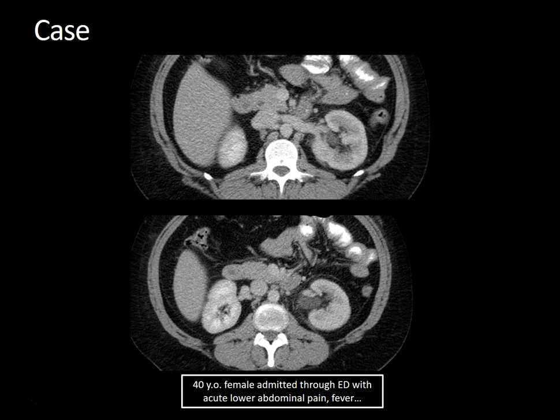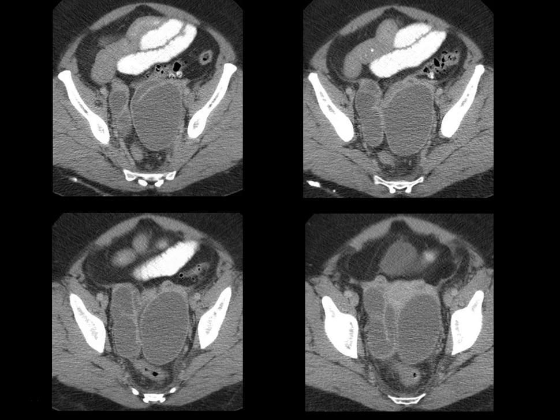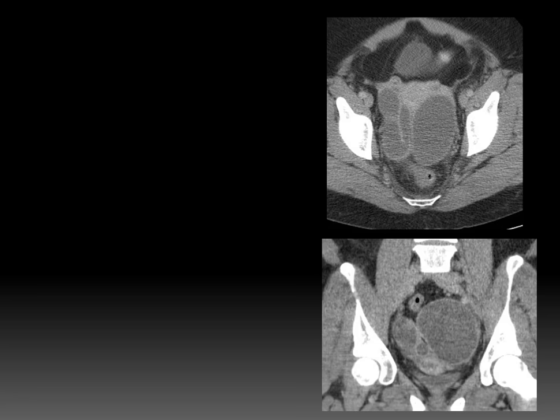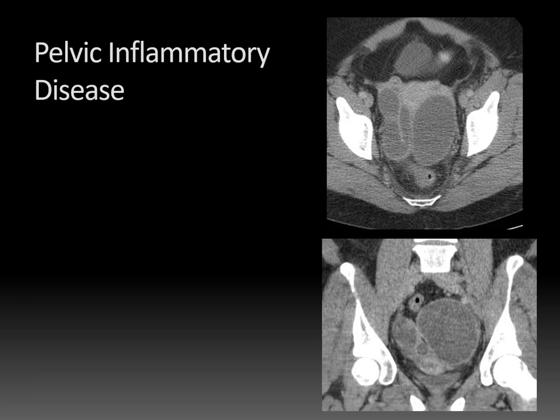Let's start with a case. This is a patient who came in through the emergency department with acute lower abdominal pain and fever. You can see there's a mild left hydronephrosis with left perinephric stranding and even a delayed left nephrogram, so your initial thought may be to consider a distal obstructing ureteral calculus. But as we move into the pelvis, you can see there are actually complex bilateral adnexal collections, left greater than right — and this was a patient with pelvic inflammatory disease.